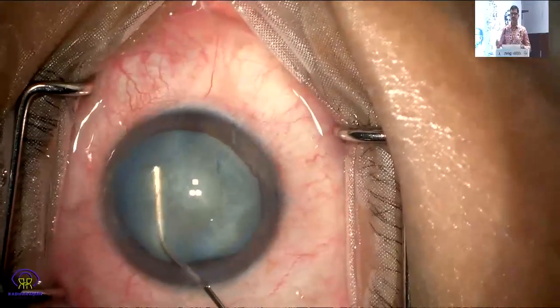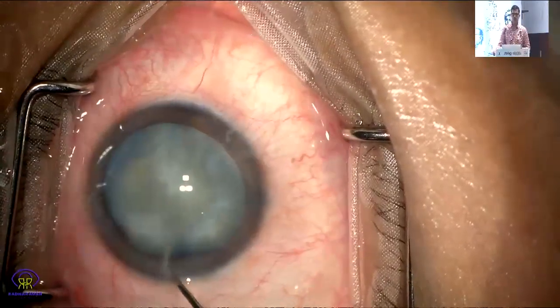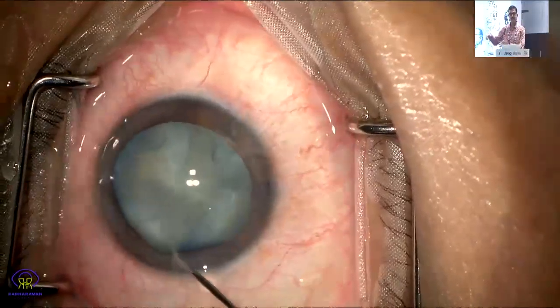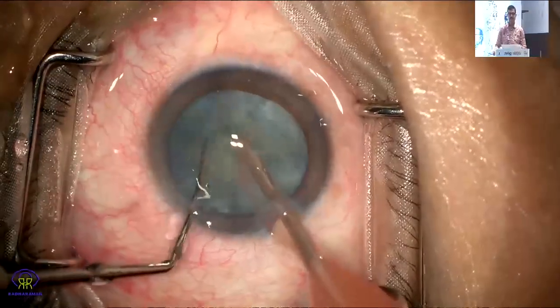As I was trying to retrieve and salvage the capsule, the other side also opened up, making it a complete Argentinian flag. So whatever I had left with me, I tried to manage with that, with very minimal rotation, trying to make a rhexis out of it.